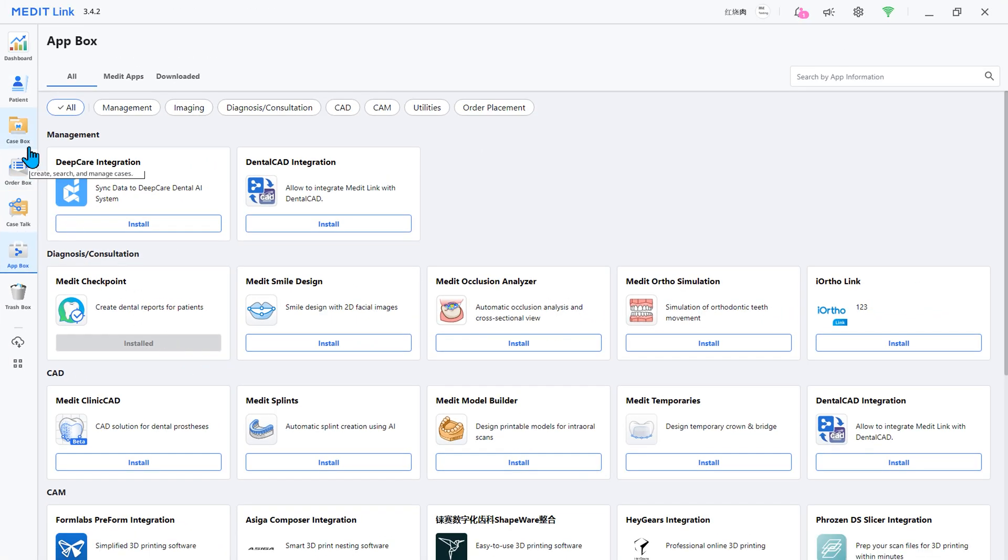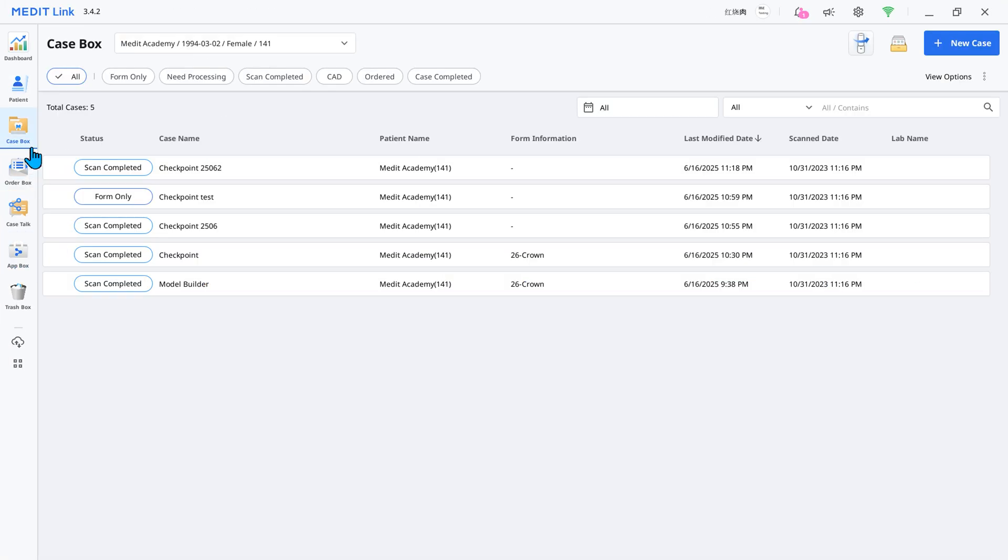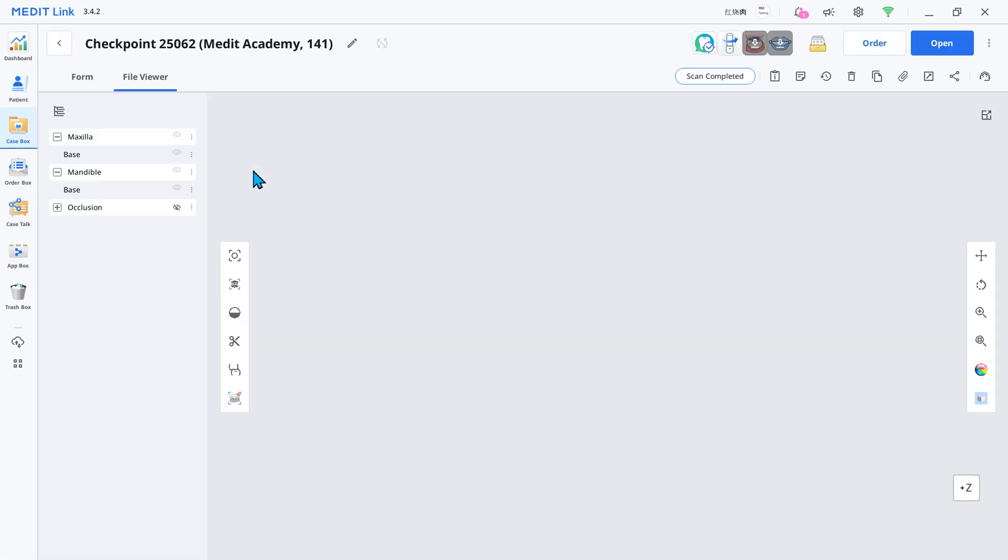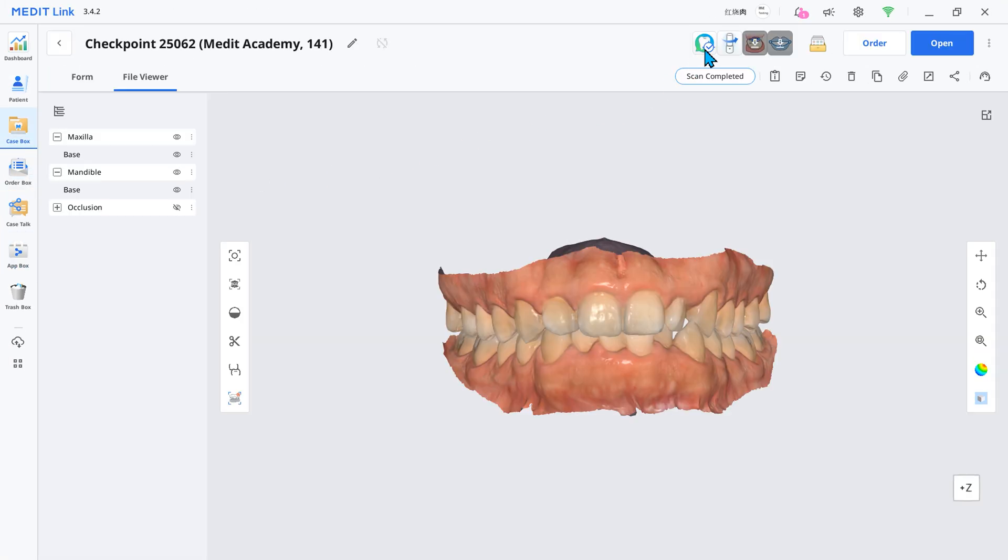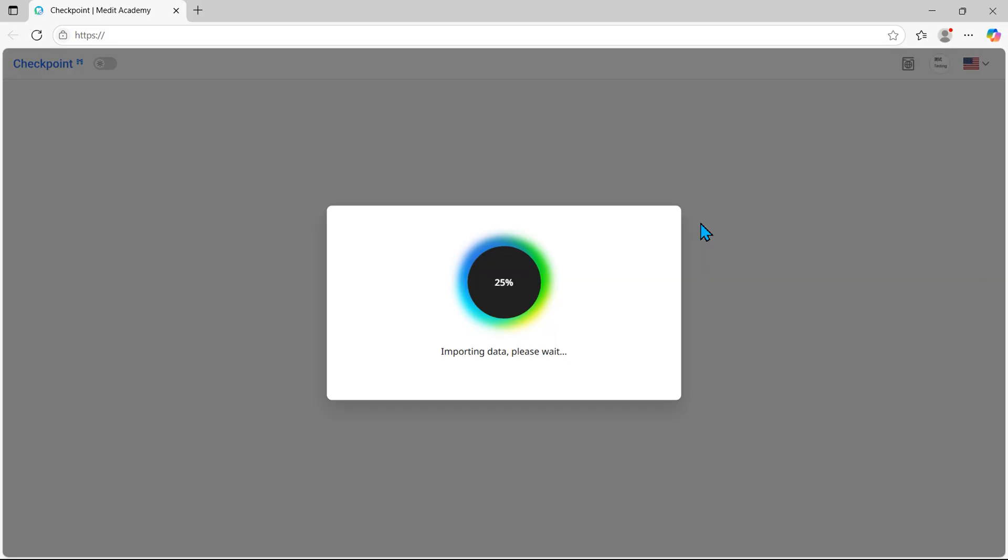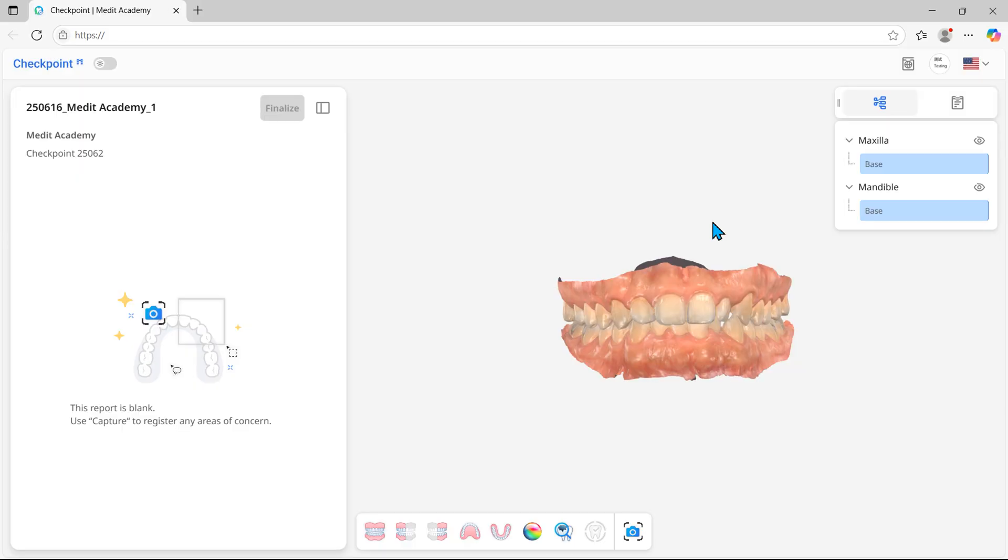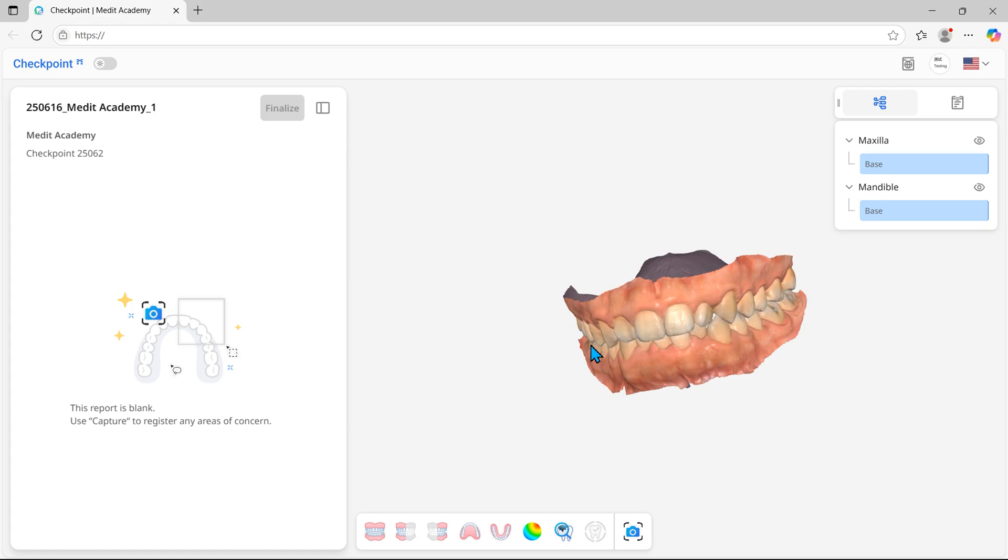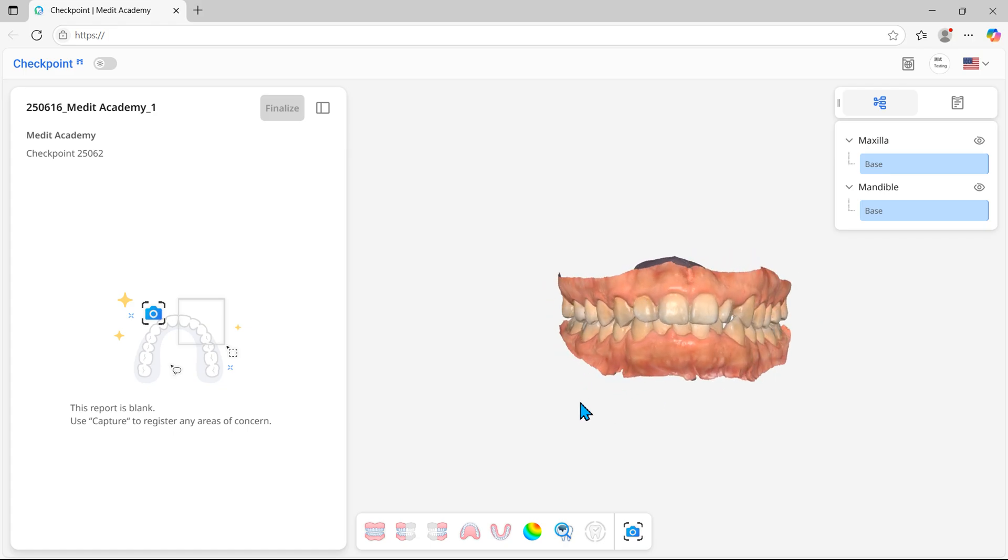Open the patient's scan data to create a report and start the app. Once the app starts on the website, it automatically loads the scanned data so you can start right away.